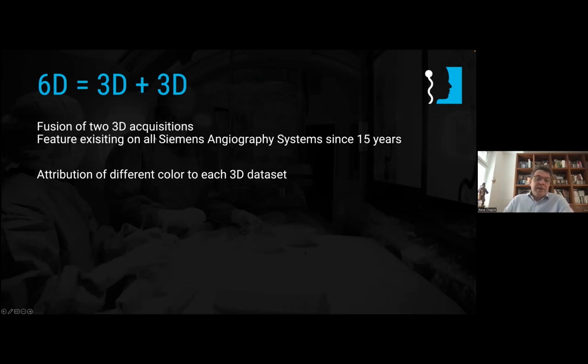So whenever you make a new rotation angiogram, the system asks you, do you want to exchange or do you want to fuse? And usually we say we want to exchange.